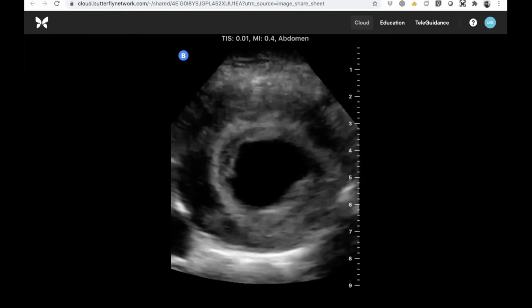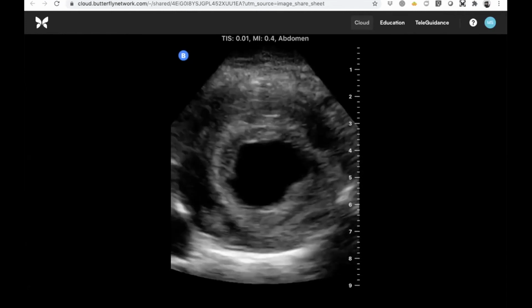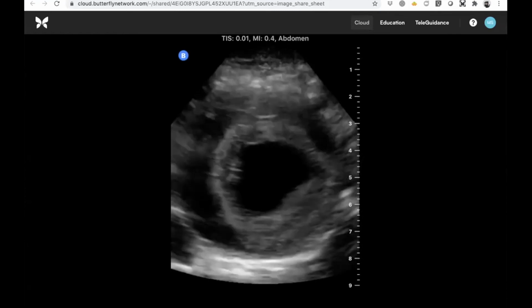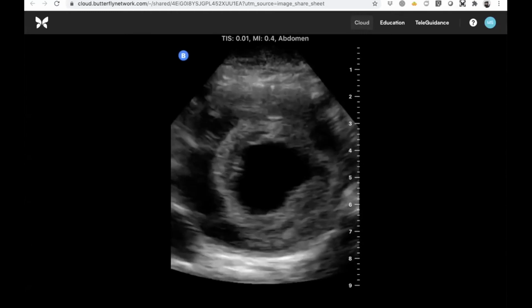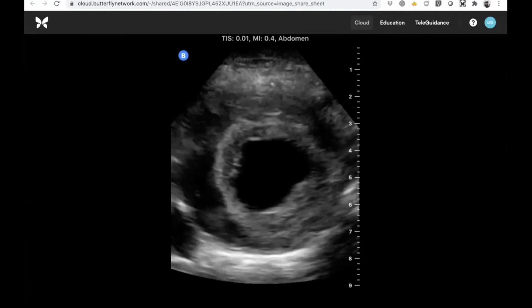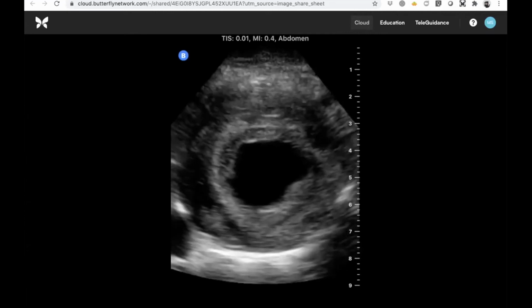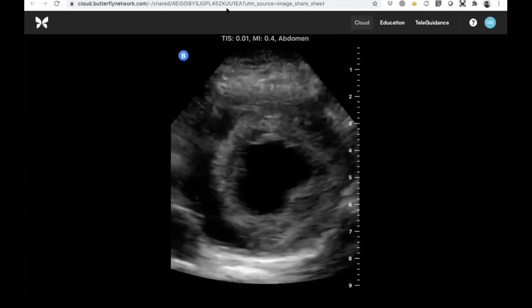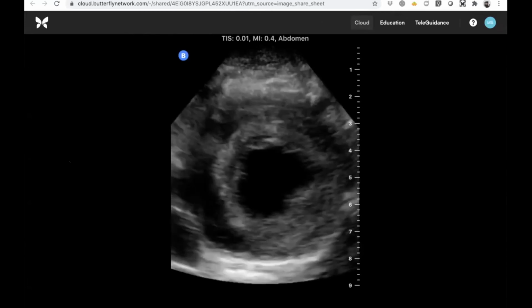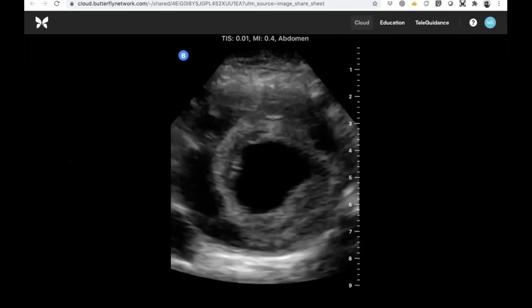Obviously with the worksheets and things and the preset, you probably would be able to tell anyway. But the one thing I would say is maybe just increase the depth a little bit so that I could clearly see the curved horseshoe spine. That landmark would let me know that this vessel on top of the spine is truly aorta. That would be probably the one thing I'd like to see from this image. But other than that, great, beautiful false lumen and true lumen here, which is a little scary.